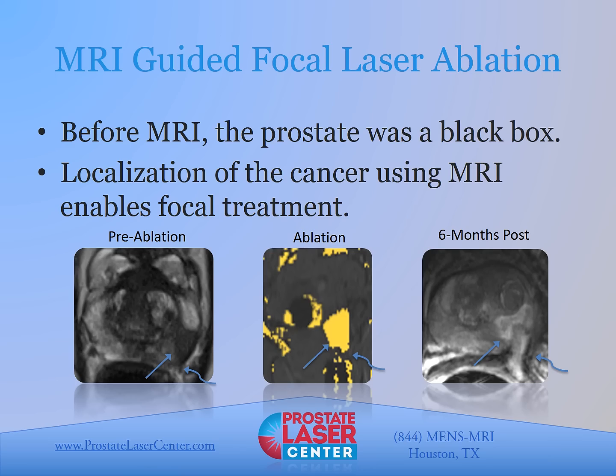Although we don't have 10, 15-year outcome data showing improved overall survival from focal laser ablation, as a radiologist, when I see a cancer, I treat it, and then I don't see it anymore. That to me is pretty powerful.